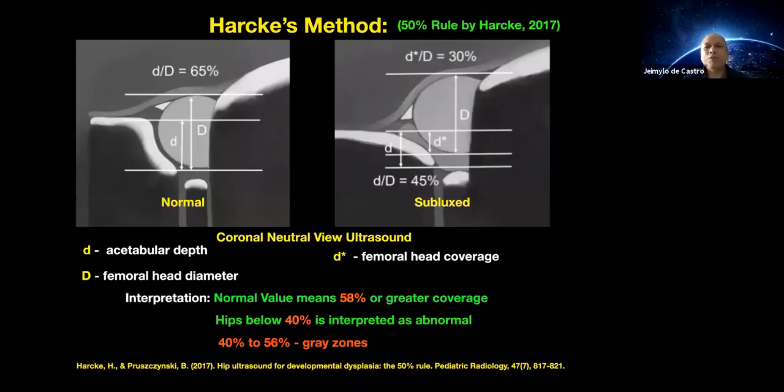Okay, now let's move on to Harcke, Dr. Harcke, an American, who made a different dynamic evaluation. What he did was to measure the different depths here.